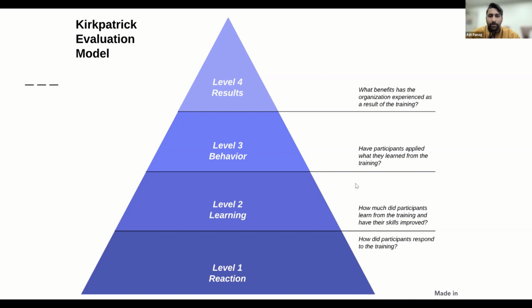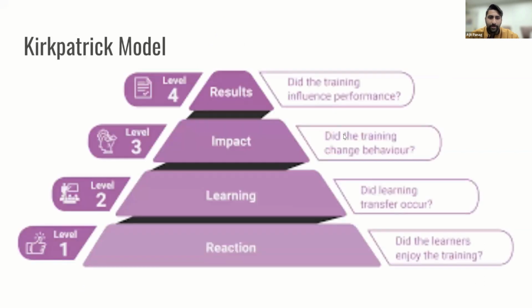So a lot of the simulation literature does not reach this fourth level, and it hasn't really shown effects on morbidity and mortality yet. But I think as we all progress into this new world of high fidelity simulation and just more simulation in general, we can really show that it has an impact. And so I think that's it. I had one more slide about the Kirkpatrick model again, just a different way of assessing it more from a learning perspective.